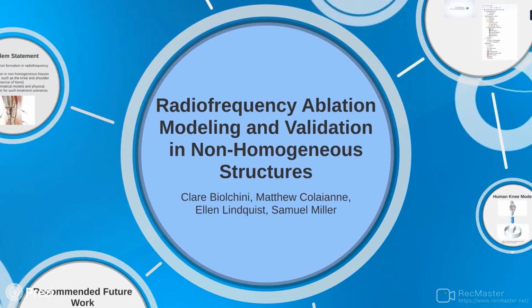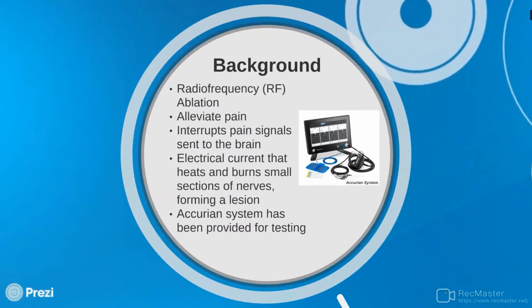We are Senior Design Team 10, and our project is radiofrequency ablation modeling and validation in non-homogeneous structures. Radiofrequency ablation is a minimally invasive procedure that's meant to alleviate pain. The process involves an electrical current that heats and burns small sections of nerves in order to interrupt the pain signals sent to the brain.